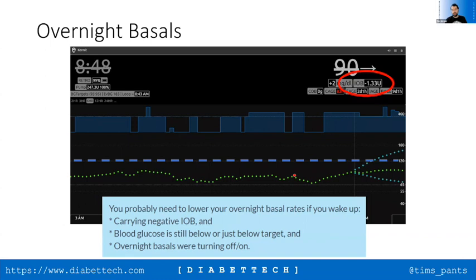I would suggest you'd want 3 consecutive days, because one of the challenges with this is that most of the way systems work, they don't pattern identify always that clearly. So if, for example, you found that on a Friday night and a Saturday night, you always had the same kind of thing over a few weeks, then potentially it's actually Friday night and Saturday night you need to make a change. But if you saw that on Monday, Tuesday, and Thursday every week, you saw something happening, then potentially what you actually need are different profiles from Monday, Tuesday, and Thursday compared to a Wednesday, Friday, Saturday, and Sunday.